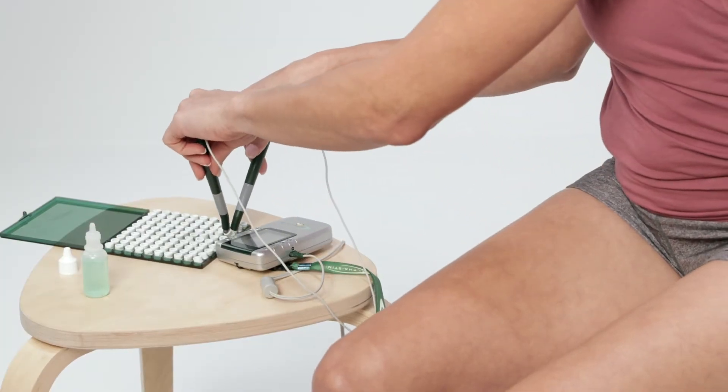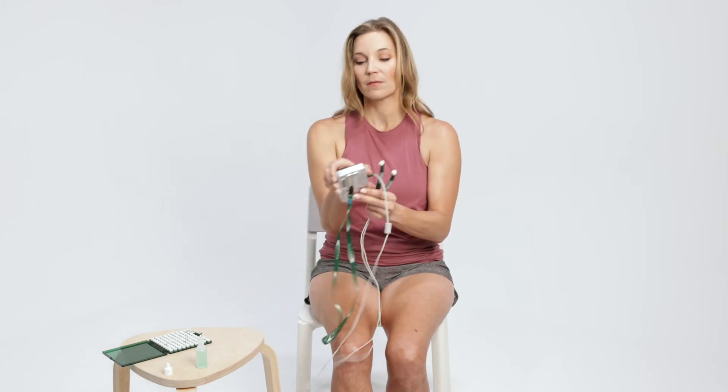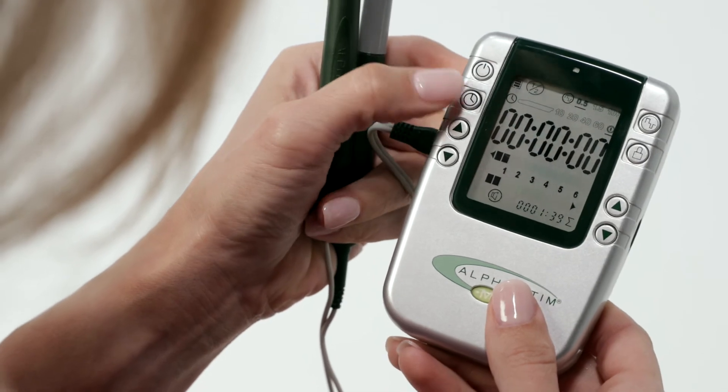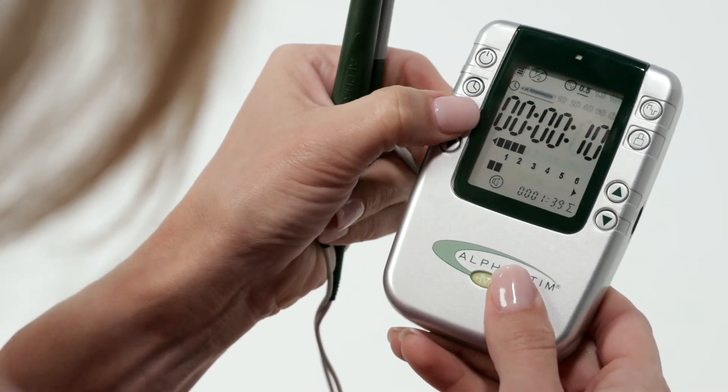The case opens with the label on the bottom to prevent pads from falling out. Press power on and set frequency to 0.5 hertz. Set timer to probe setting. Set current on the channel in use to 6, 600 microamps.